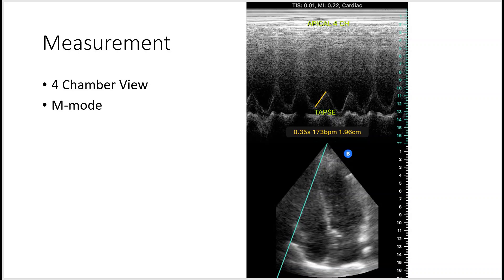To measure the TAPSE, you first put the echo in four chamber view, and then switch to M-mode. In M-mode, you align the line along the lateral wall of the right heart chamber walls, where the tricuspid annulus is. And then you'll get something like this.